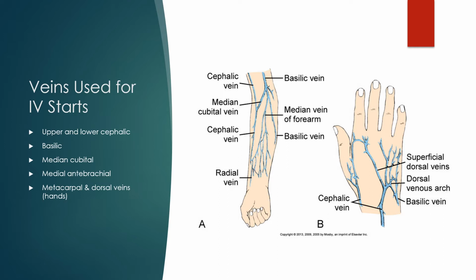So the next area is the forearm. This is a great area with lots of good choices. As we keep moving up the arm, we get to that AC area, and then we worry about the patient bending their arm and occluding that IV. So again, non-dominant would be better. We might need to put an arm board on them just as a reminder to not bend that arm. But also see there are some bifurcation areas there too.